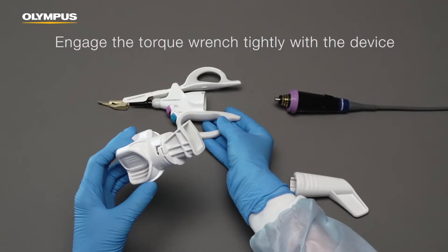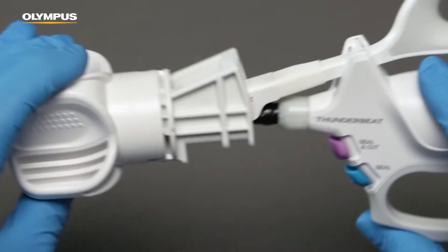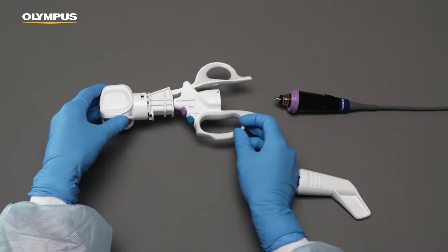First, place the torque wrench firmly on the jaw. Make sure the device and the wrench are firmly engaged.